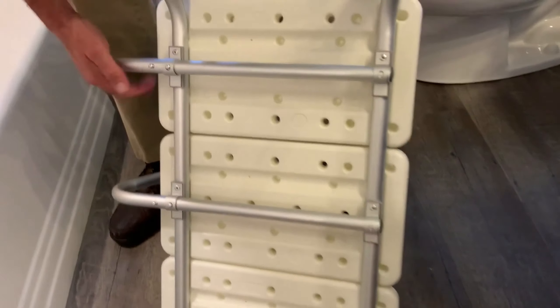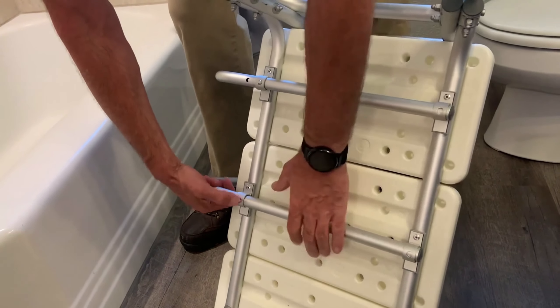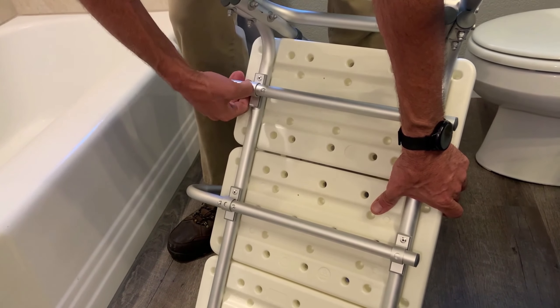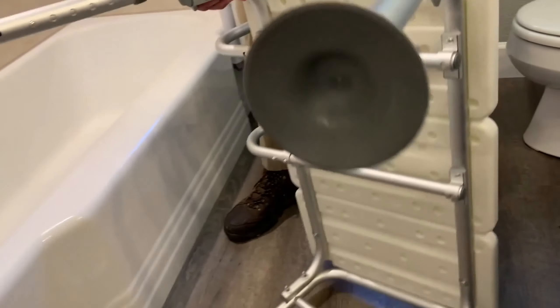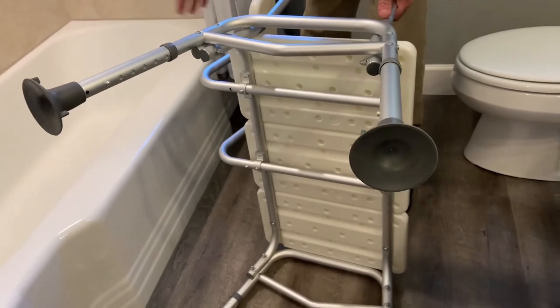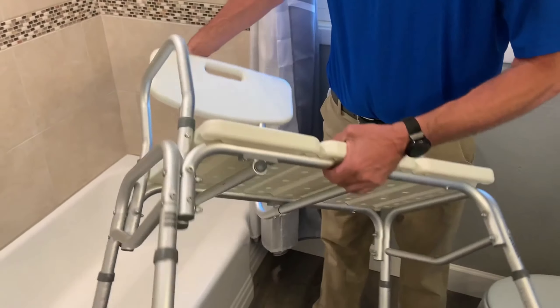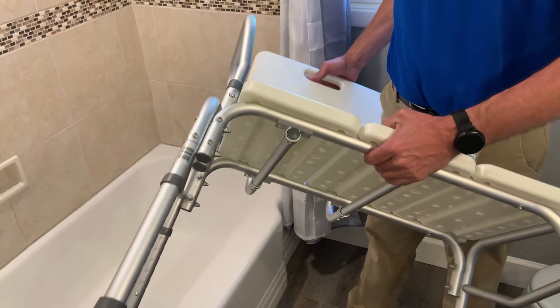Make sure those brackets lock in. If you need it a little further forward, there are two adjustments on this one. If your shower head is facing to the right, you would just take this back off and slide it in on this side, and then you can use your shower with the shower head facing to the right.